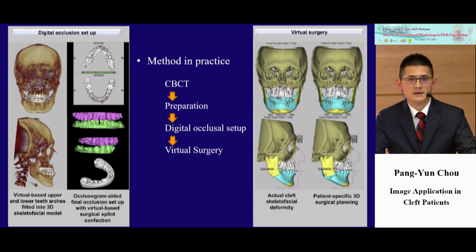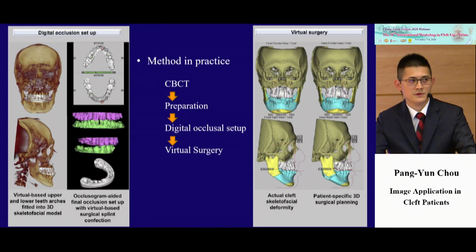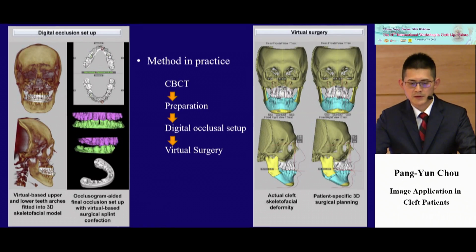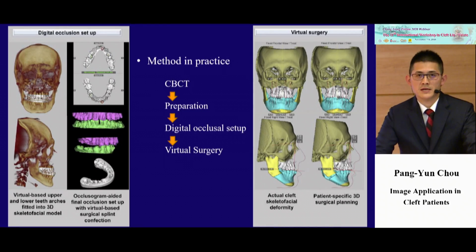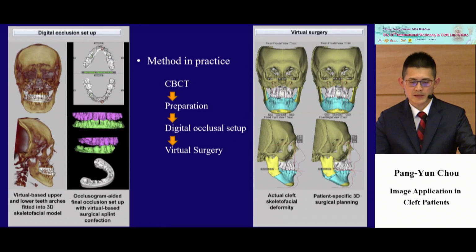You can, depending on your style of delivery, maybe design the maxillary first, or you can design the mandible first. And the two-splint modality is now very frequently used in our daily OGS procedures. So once the virtual surgery has been performed or prepared, a lot of advantages can come up and could happen in your real practice.